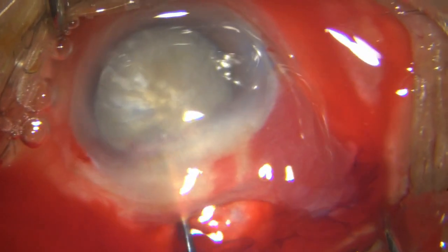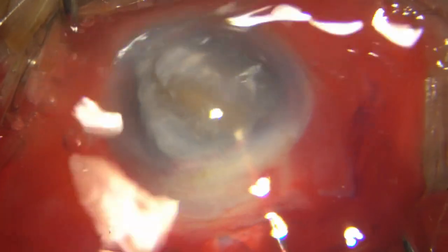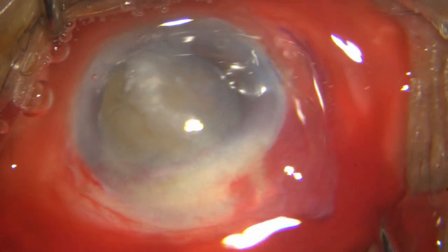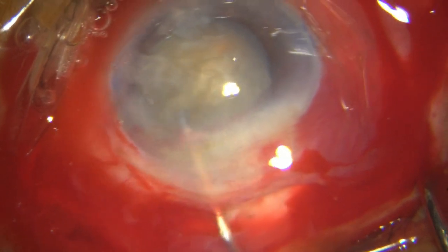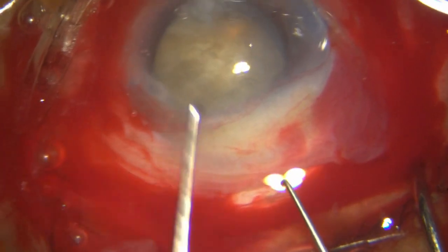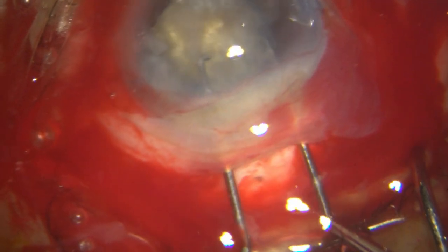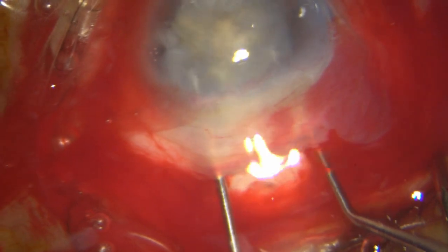I rotate, yes, that's the nucleus rotating, and this one is tumbling, and this can happen, especially when the globe is too soft. Very difficult to rotate the nucleus out into the AC. So I abandon that procedure, reposition it into the bag, and go for my 2 dialer procedure. And look what happens here. Actually, I'm only catching cortex, not able to go under.